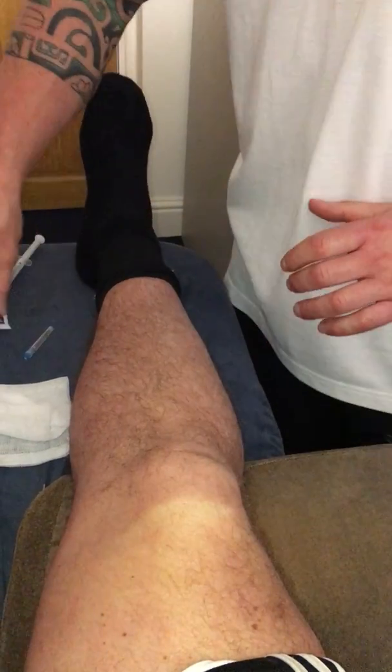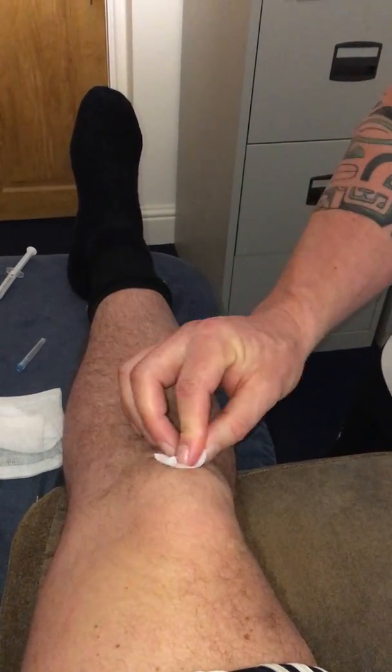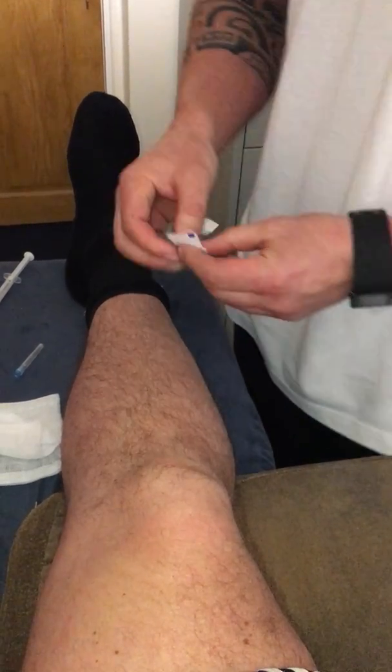Mark the area and we're going to swab the area to clean it. This is a non-touch technique, so basically once we've cleaned it, we don't touch the area again due to risk of infection.